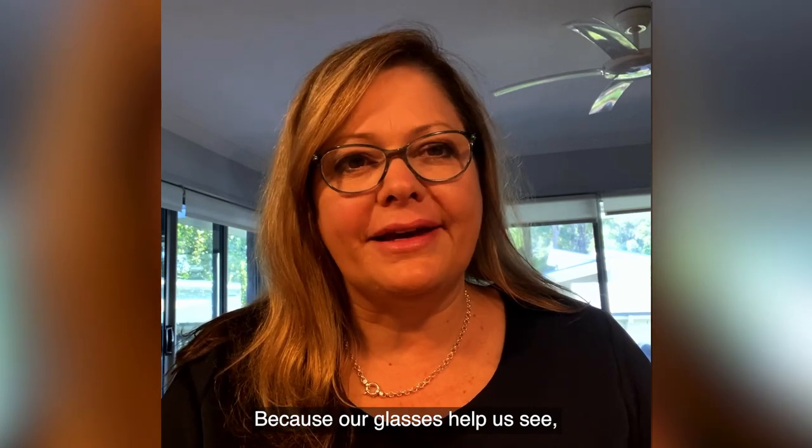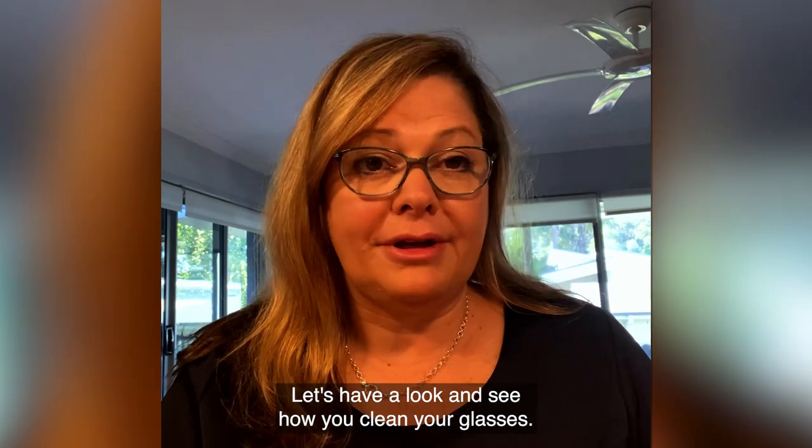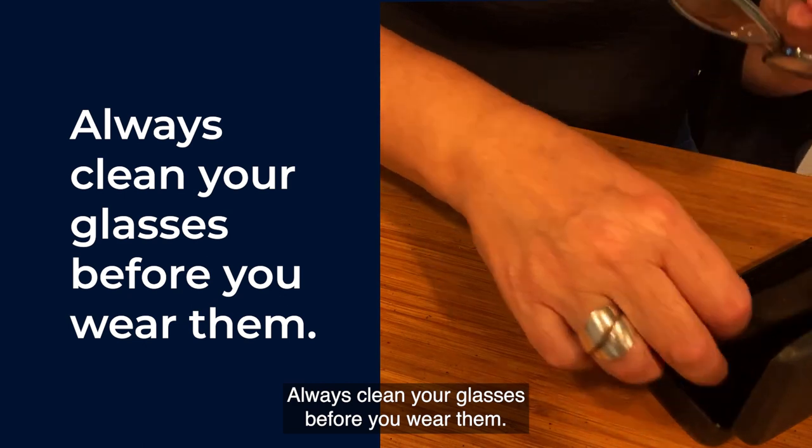Because our glasses help us see, it's good to keep them clean. Let's have a look and see how you clean your glasses. Always clean your glasses before you wear them.